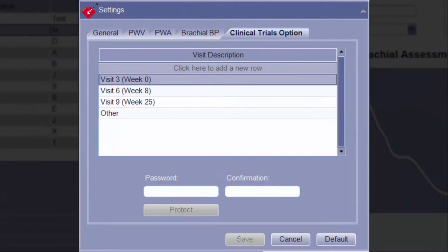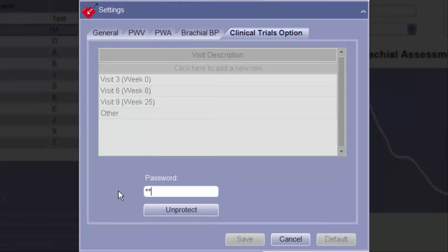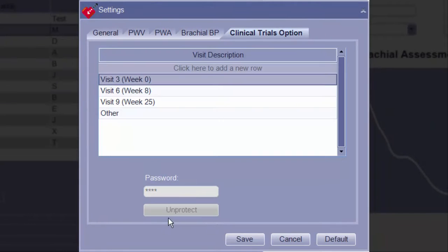The Clinical Trial option also allows the ability to password protect the entire Settings window. To enable, type a password in both the password and confirmation fields and click Protect. No settings can be changed on any tab until the password is re-entered and Unprotect is clicked.